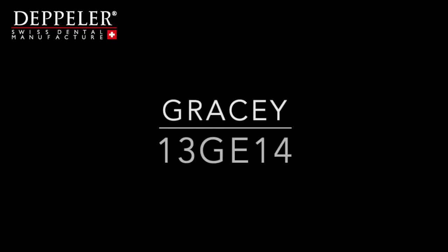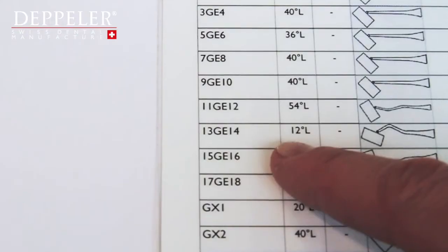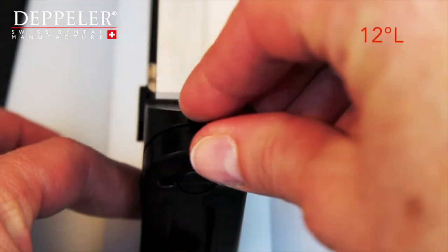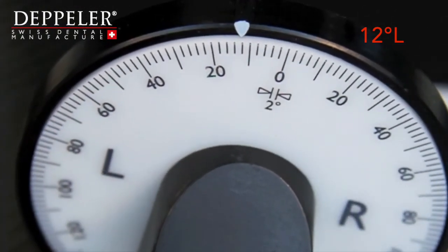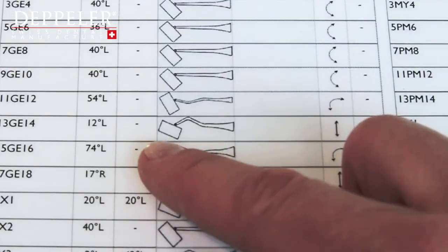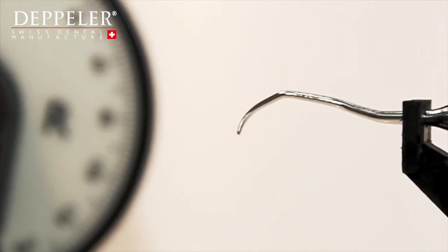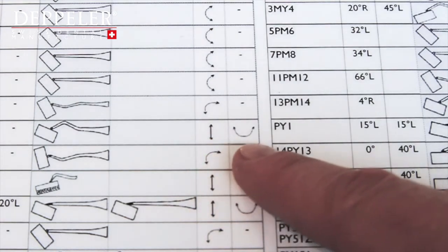Repeat the operation with the Gracey 13-14 curette. Fix the instrument and adjust the angle. Refer to the drawing that shows the instrument's positioning on the stone. Check the movements of the stone and those of the instrument.